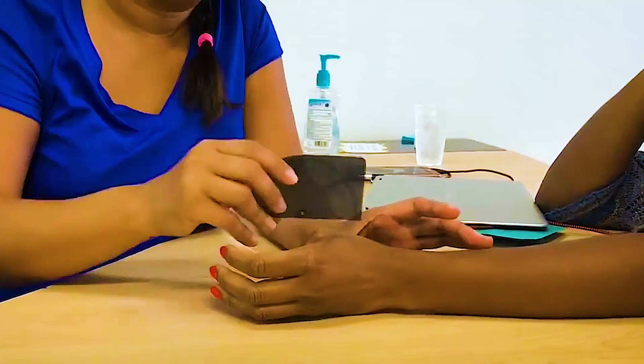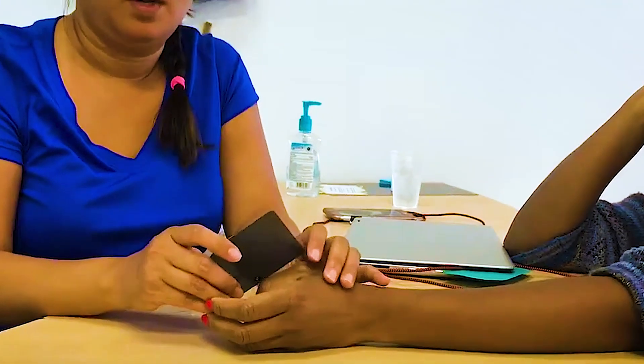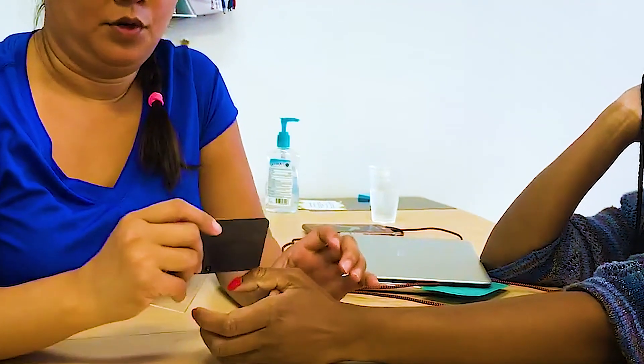The way I measure the thumb — just move the fingers out of the way, bend your thumb all the way down as much as you can, and this is going to sit right over the MP. Then you can do the IP. If they have a really great range of motion and you can't measure their IP, just bring their MPs up — bend your little knuckle and then you can measure that. CMC measurement is usually through opposition. Can you oppose to the small finger? Bring that thumb all the way down — this is composite — all the way down to the distal palmar crease. You'll look at the other uninjured hand to determine what is their normal. This covers range of motion of the fingers, thumb, wrist, and now supination and pronation.